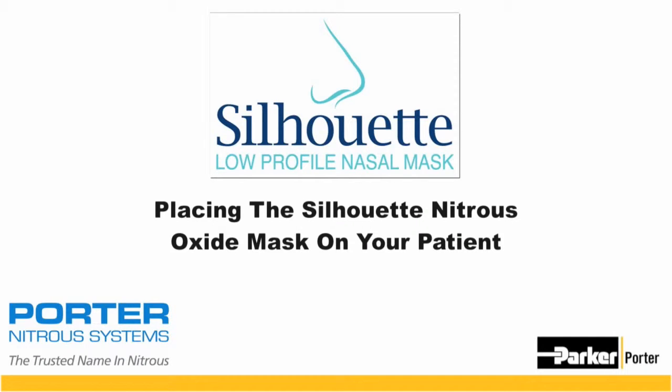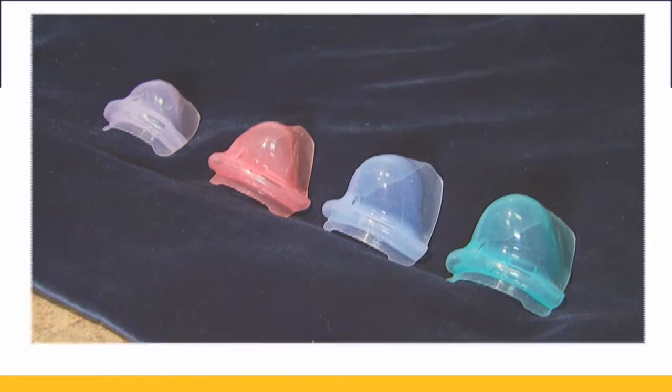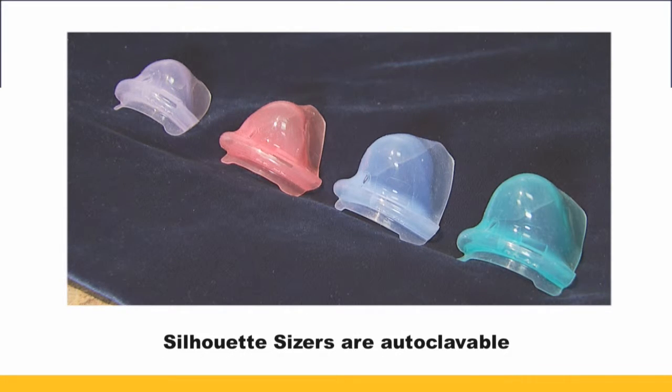Today we're going to walk you through the steps to place your Silhouette Nitrous Oxide Delivery System on your patient. The first thing you want to do is look at your Silhouette sizers. You will have four sizes to choose from. You want to take a look at your patient's nose and make sure you're choosing the best size for their nose.